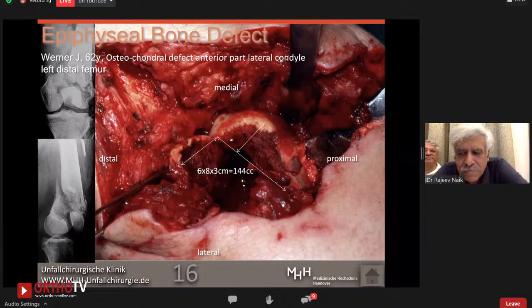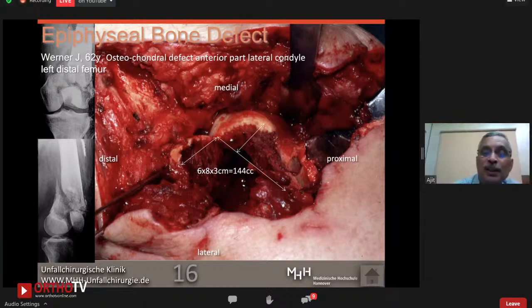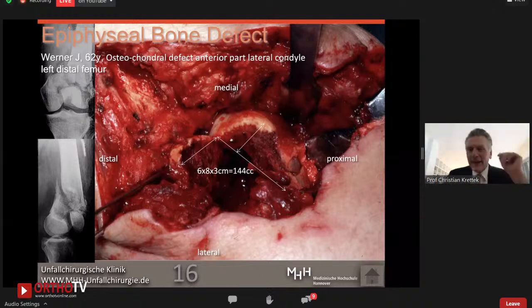Okay, good point. Prof, is there a CT? Because I'm not able to figure out where exactly the bone loss is from. Is that the medial condyle? It's a lateral condyle and the anterior part. So what you see here is medial. This is lateral. Left is distal. This is proximal. And bottom is lateral. So we see from anterolateral onto the wound. And unfortunately, this is a case from the 90s. So in that time, we haven't done regular CT scans. Now we do, but at that time, we didn't.